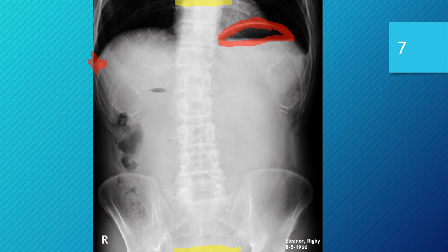This one's really close. Arguably, of course, as a new technologist, you want to be critical and really strive to get that really great image. I can't say perfect because nobody's perfect, but that really great image. So knowing that all you had to do was shift your patient slightly to the left to get a near perfect image, it would be worth repeating for this.